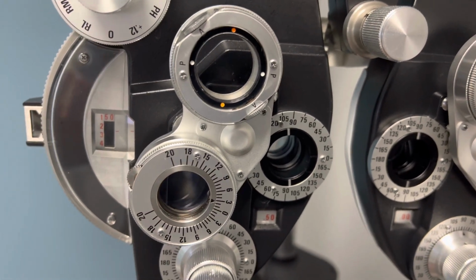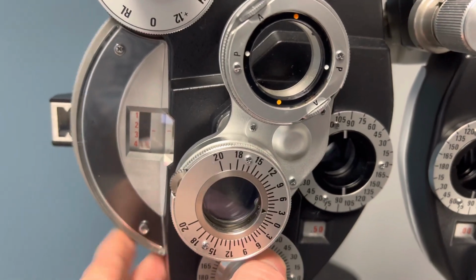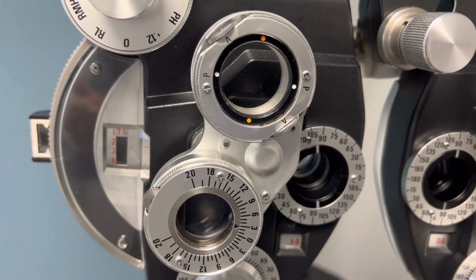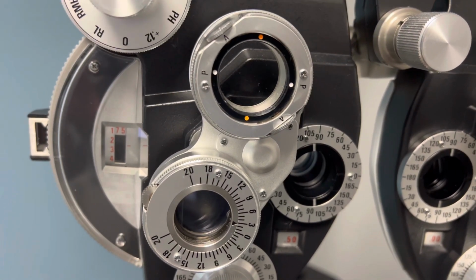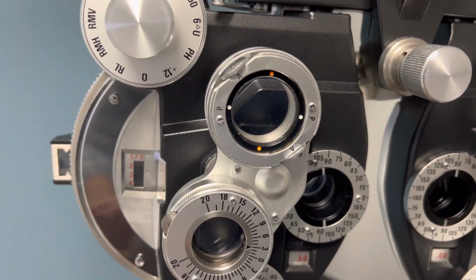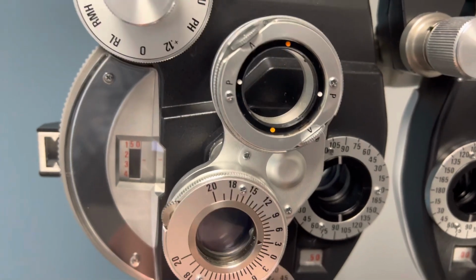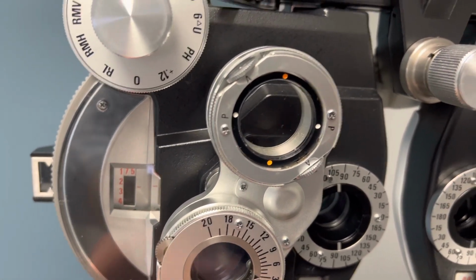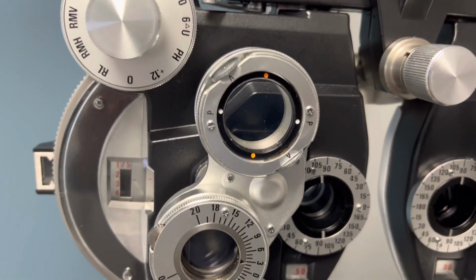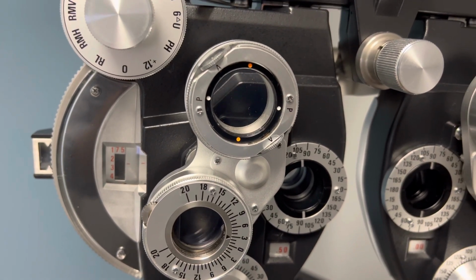Now, if I were to come back and say, which one of these looks better, 1 or 2? If I give you an extra click, generally when you're nearsighted, you're always going to pick the higher power. But this may not necessarily be what you need. If you can see 20/20 with this, it may not be a great idea to give you this. And so if I give you this extra power here, sometimes when you're reading or doing some up close work, it can cause headaches or eye strain.